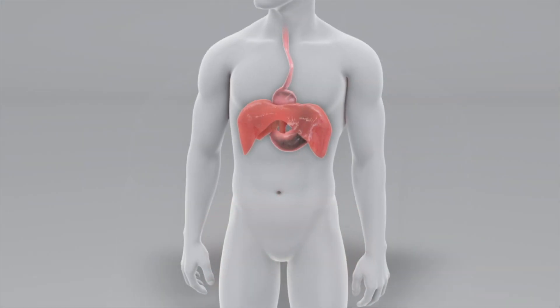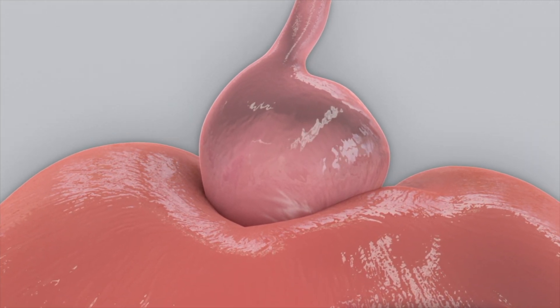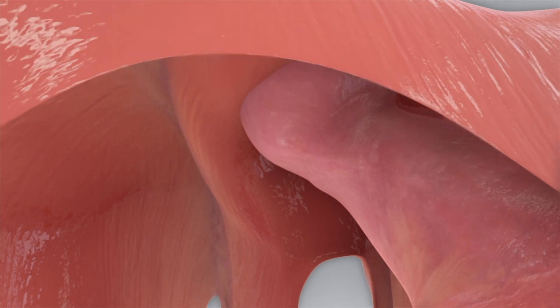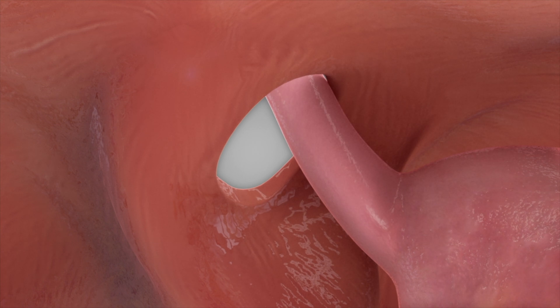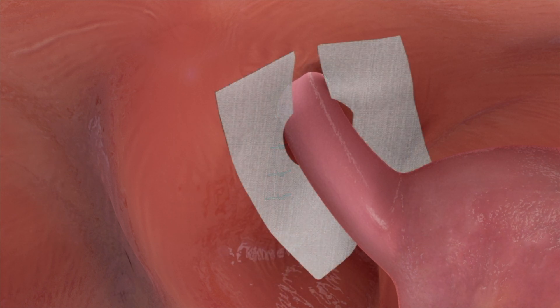In order to maximally control reflux surgically, both the hiatal hernia and the abnormally relaxed LES must be corrected. First, the hiatal hernia is repaired. Surgical repair essentially involves pulling the stomach back into normal position fully below the diaphragm and making the opening in the diaphragm smaller. A mesh is then placed over the incision to reinforce the closure to minimize risk of hiatal hernia recurrence.